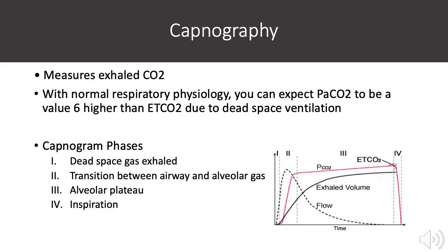The beginning of exhalation is dead space. This is followed by the transition between airways and alveolar gas. As the waveform levels off, it corresponds to the alveolar plateau or end-tidal carbon dioxide. Finally, as inspiration starts again, the waveform should reverse flow and drop to 0.